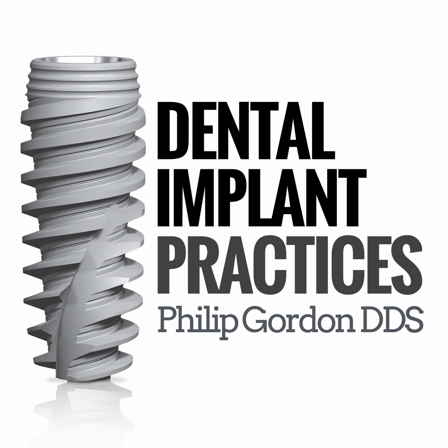I do some on-lay grafts from time to time when we've got a lot of deficiency, let's say in the posterior mandible, although I've been doing a lot more just using freeze-dried particulate, using the Symbiose graft along with a product called Amnio Matrix or Amnio MTM. It's an amniotic membrane-derived growth factor mixture that's got a lot of growth factors, prostaglandins, and stem cells.